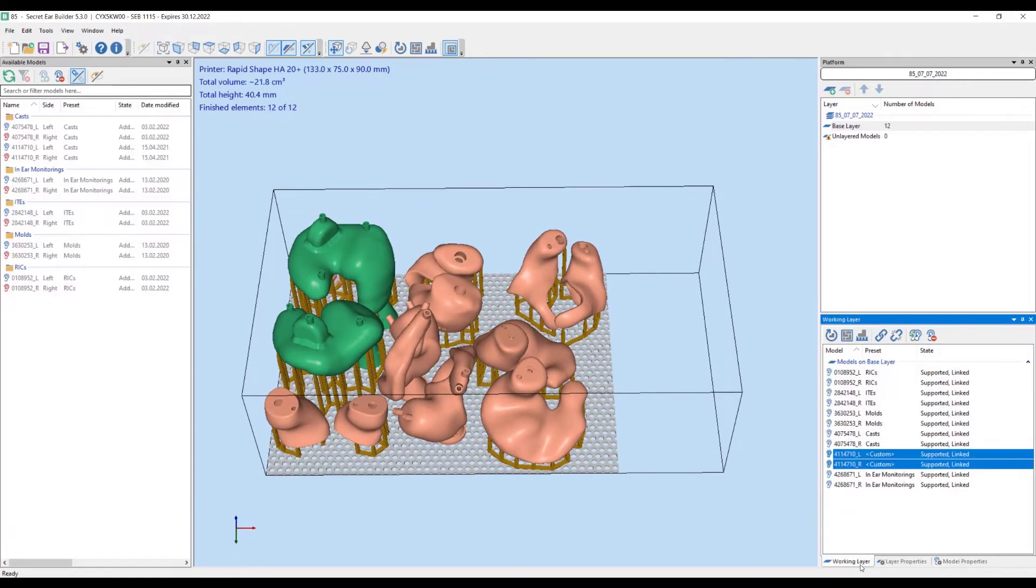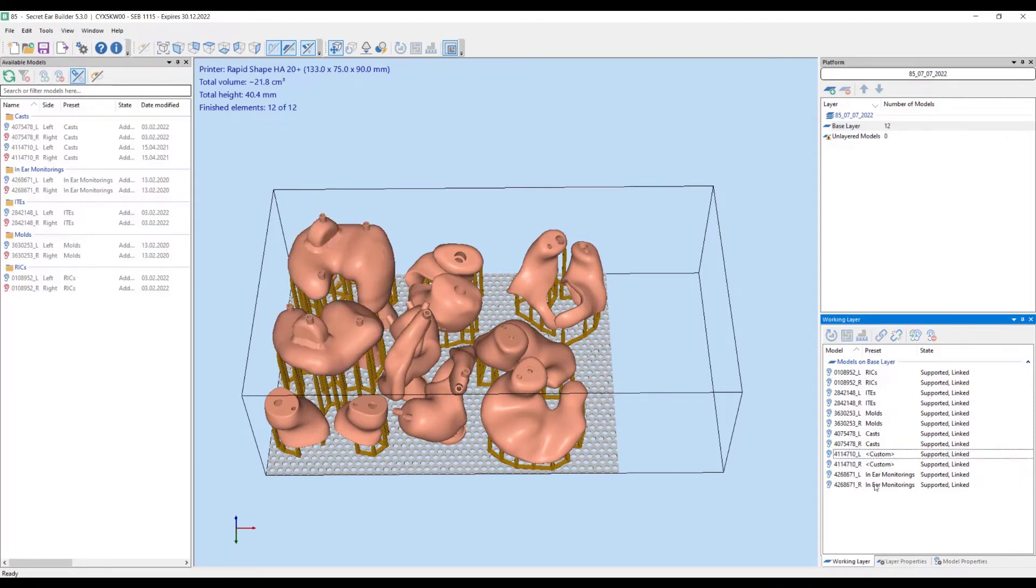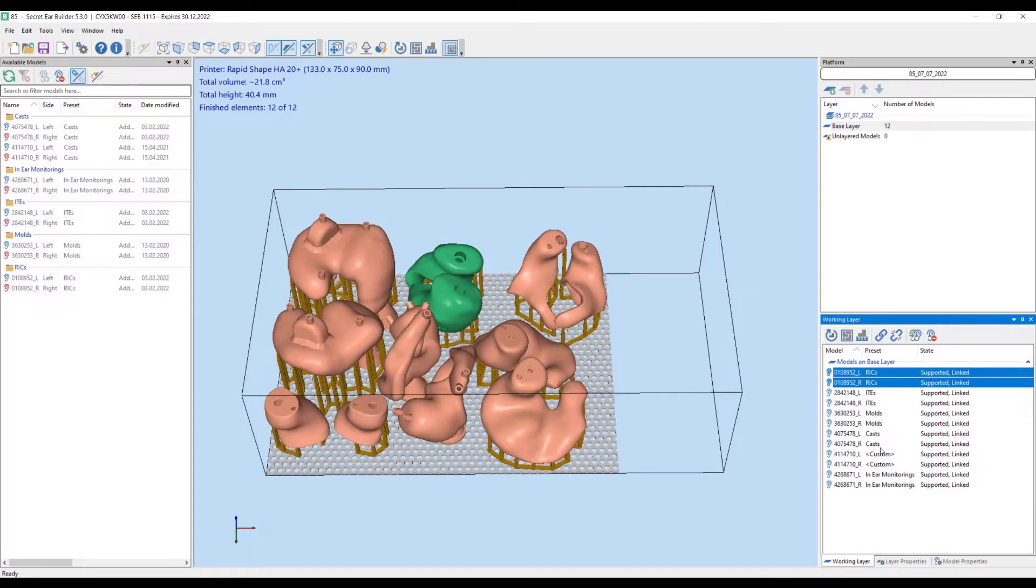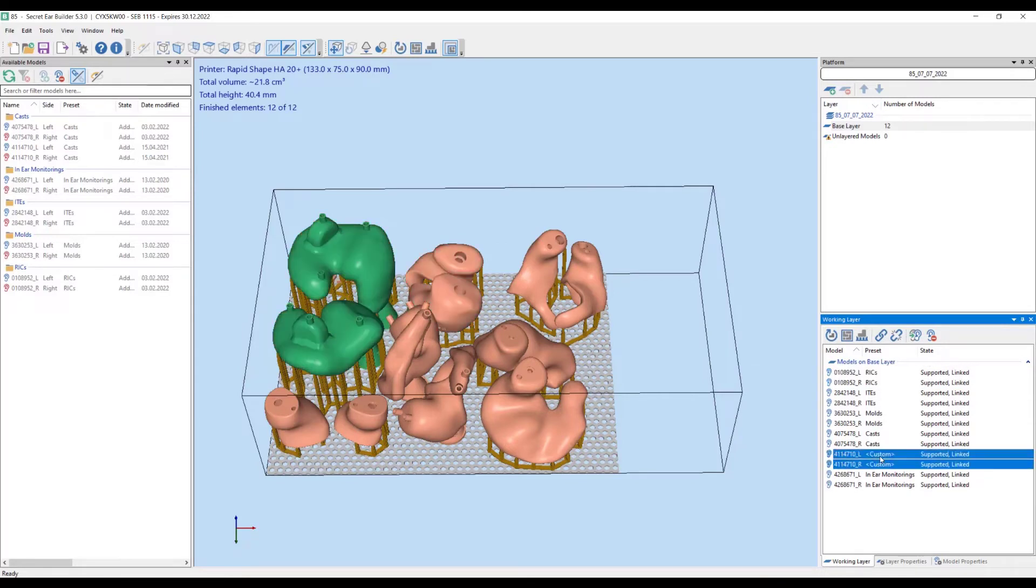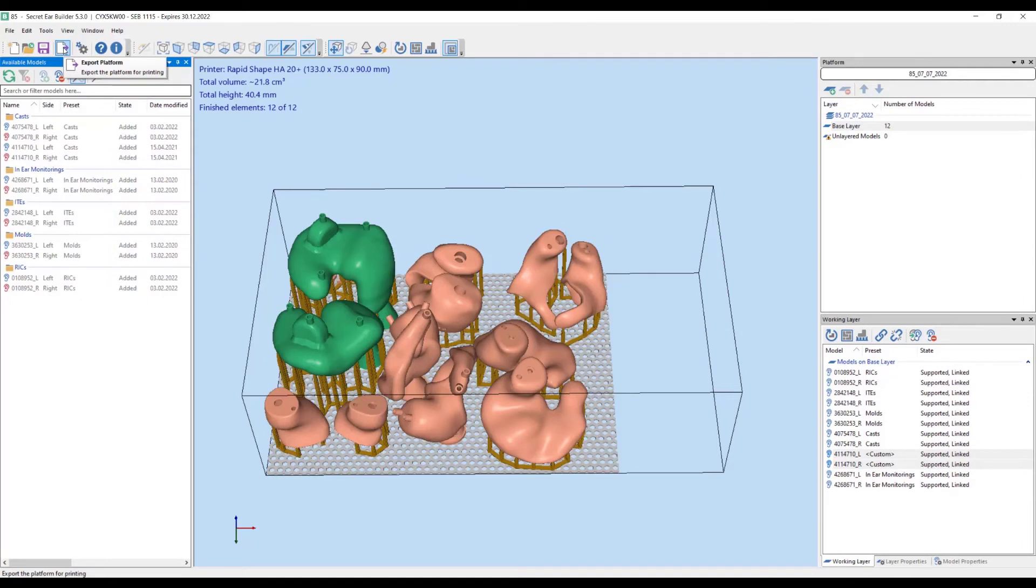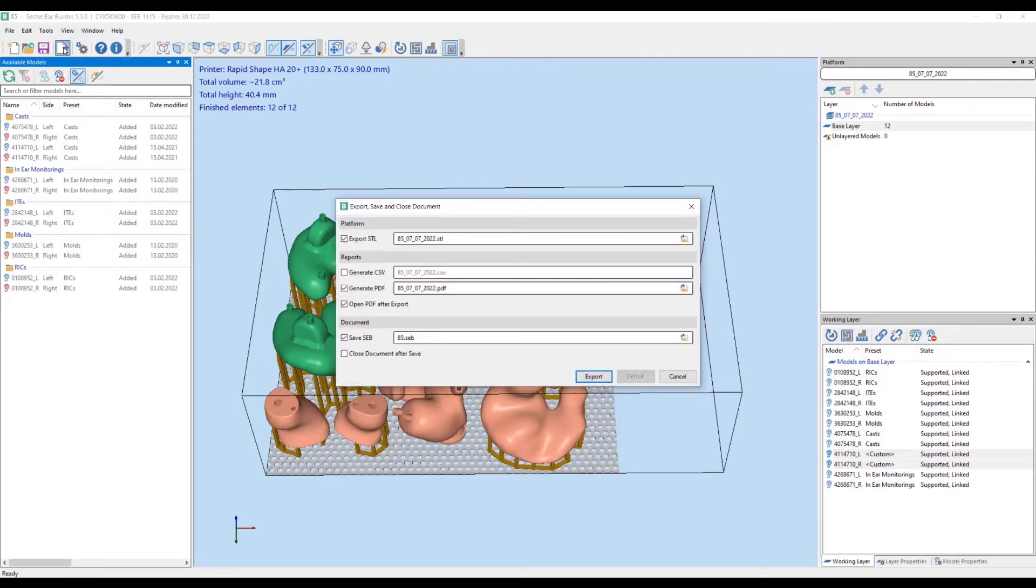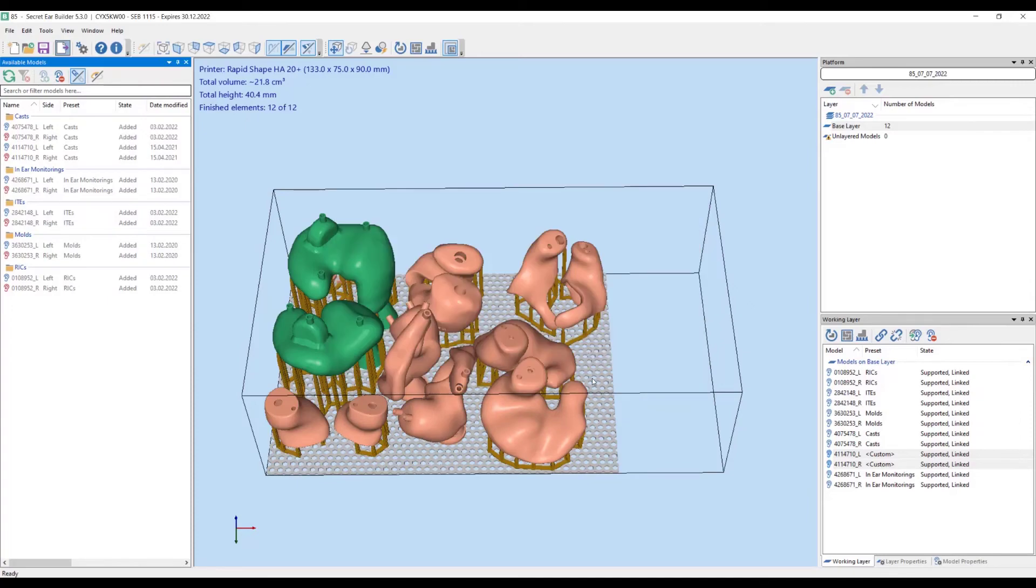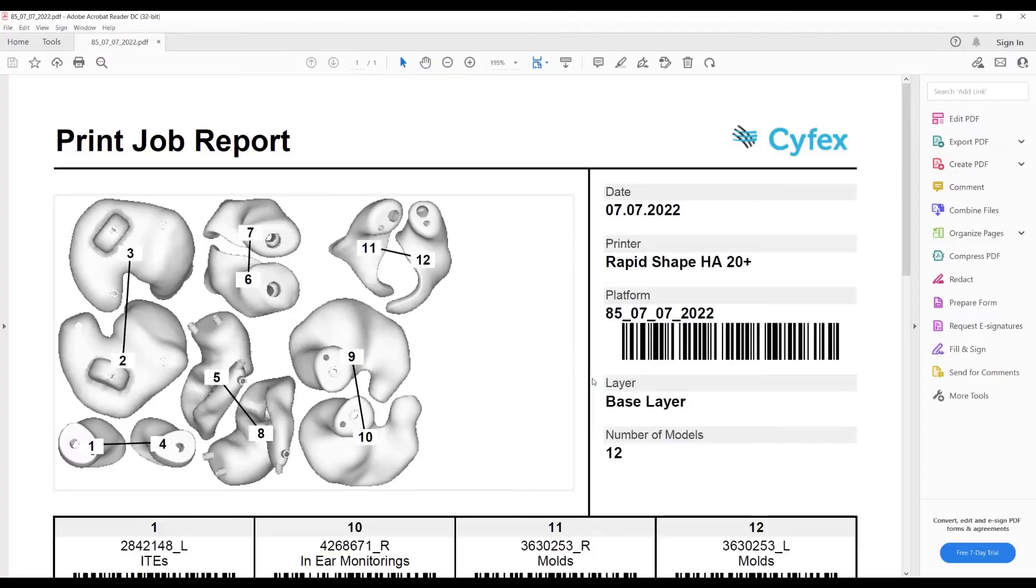We review our build. All the models have been added. The list on the left hand side of the screen confirms it. We click on the export button and the export dialog appears. A PDF print job report opens automatically.